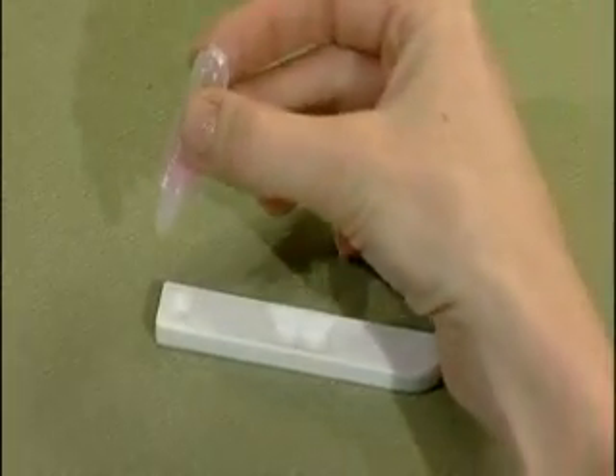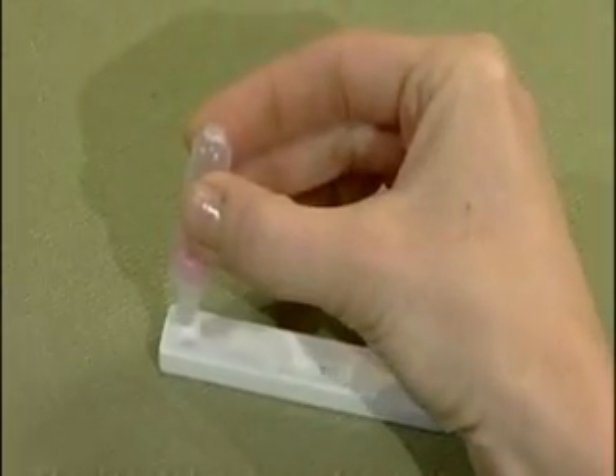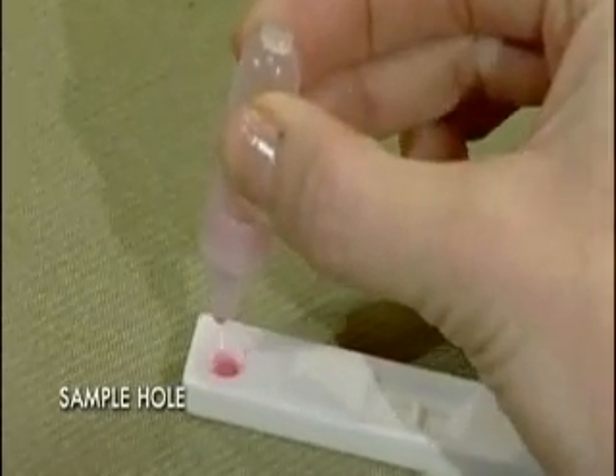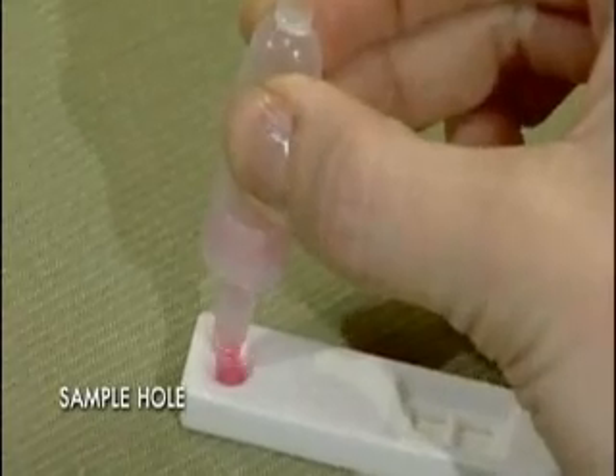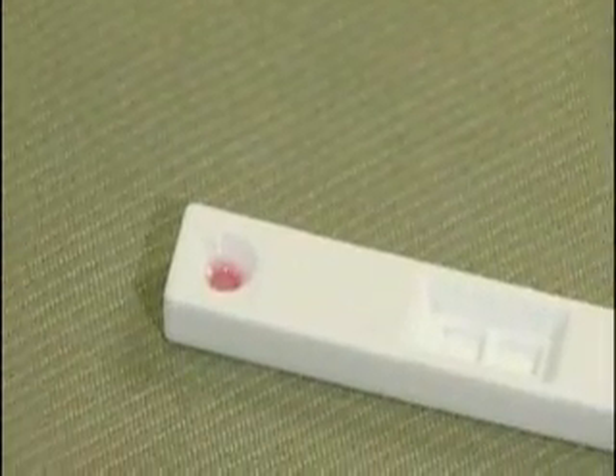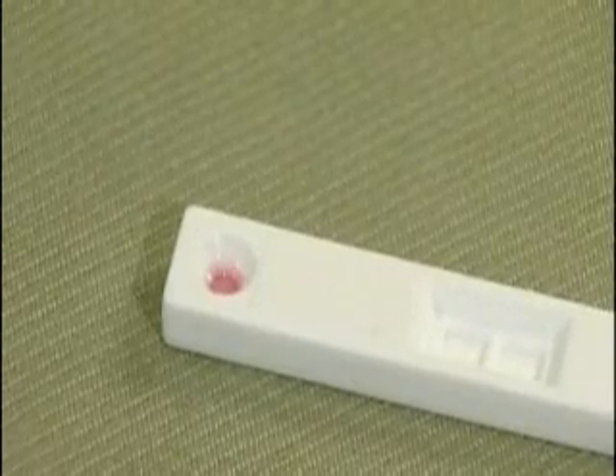Hold the clear buffer vial containing the diluted blood sample vertically over the round sample hole labeled S, and gently squeeze three drops onto it. After applying the drops, do not touch or move the BioCard test strip.